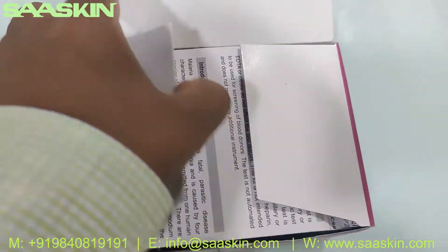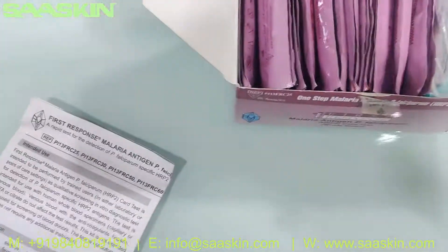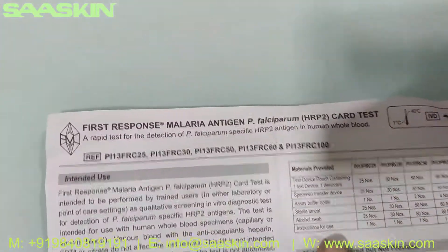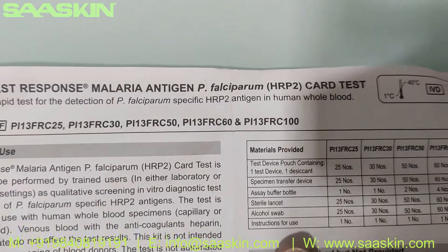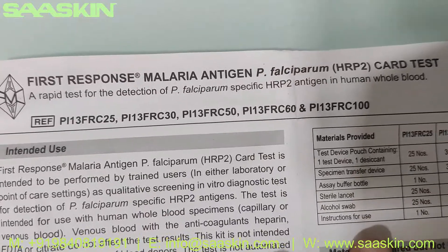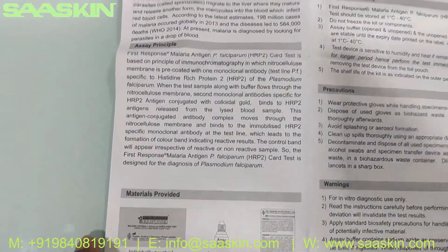Okay, I got it open. Inside the box you've got an IFU brochure — that's the Instruction For Use. This brochure covers completing the total test. You can see it says First Response Malaria Antigen PF Rapid Test Kit, and it's for the detection of P. falciparum-specific HRP2 antigen in human whole blood, with complete instructions inside.